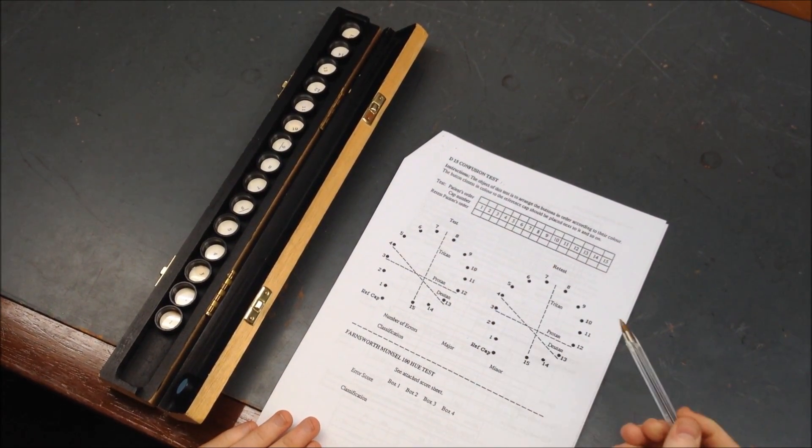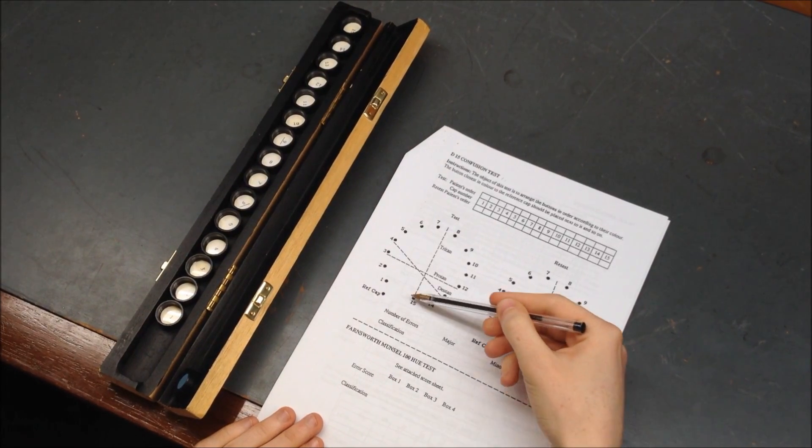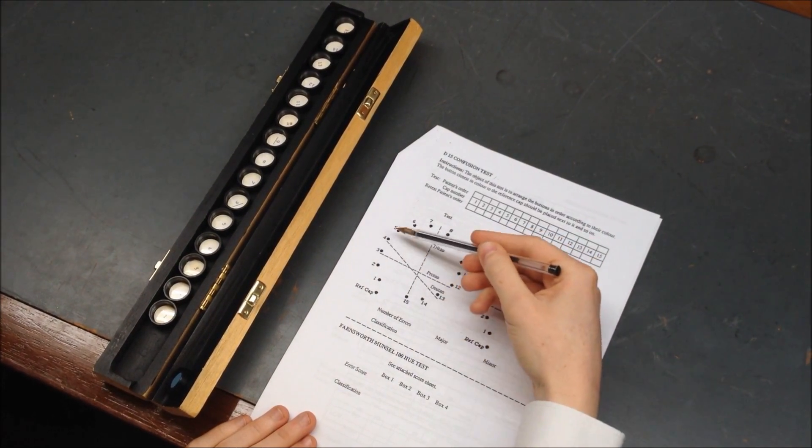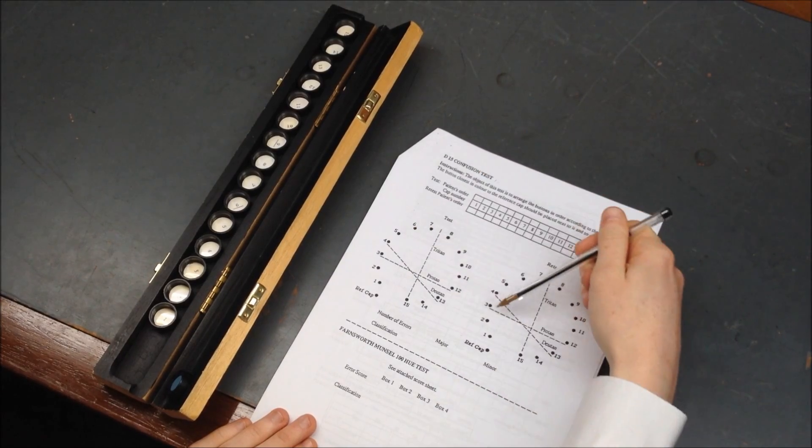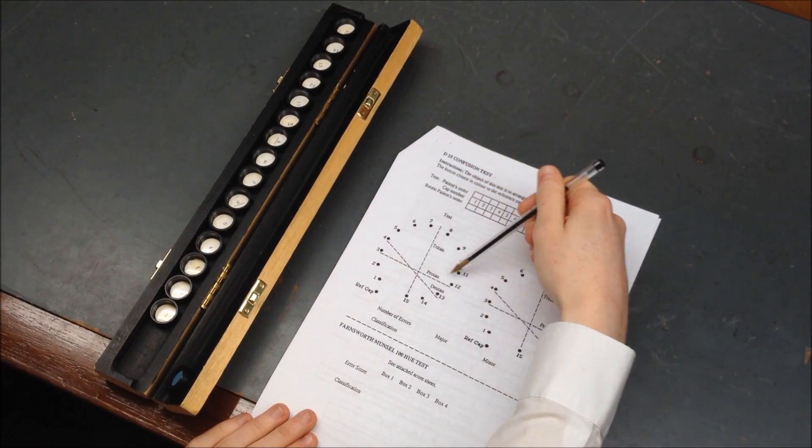In the case of a typical Tritan defect the lines would go up and down like this. A Deutan across the way and a Protan defect horizontally.